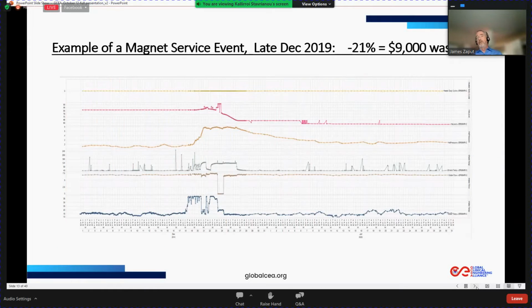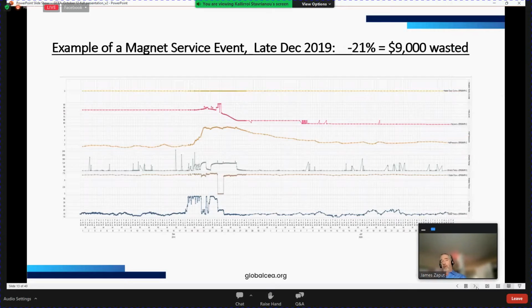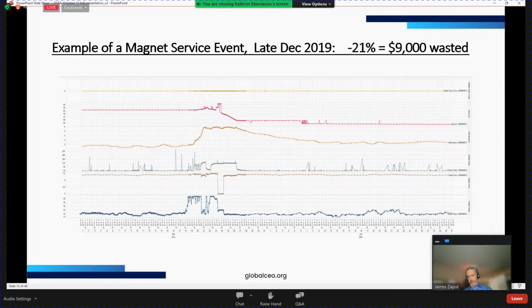So as a clinical operations group, you either worry yourself or you want to know what your service provider is giving you for that magnet maintenance and cryogen contract. It has become all magnet maintenance in recent years, the last decade. In a world that doesn't have an infinite supply of helium, in a product installed base that is by and large zero boil off, does not consume helium on normal operation, what are you worried about? What does a service provider worry about? We worry about preservation of helium, conservation of helium.